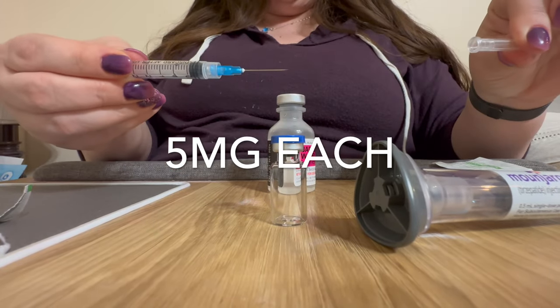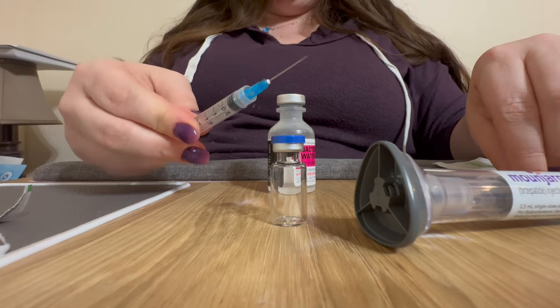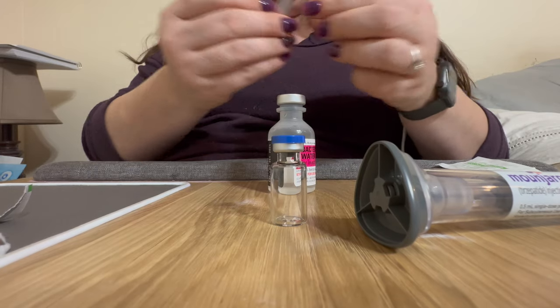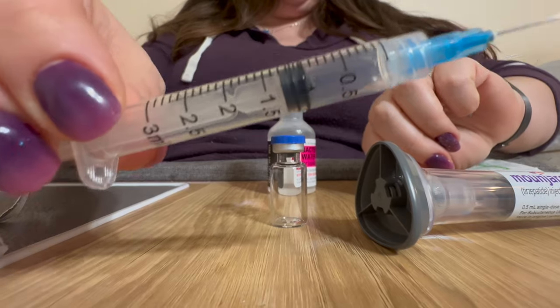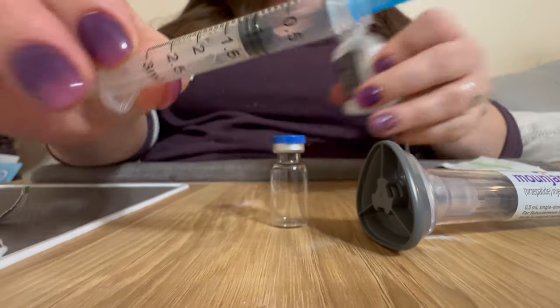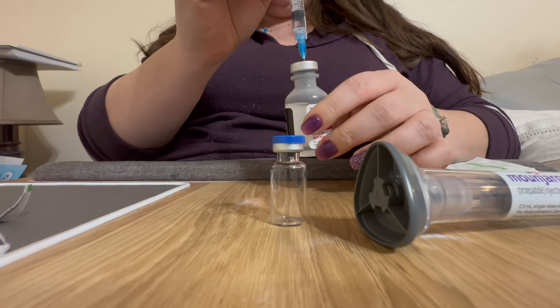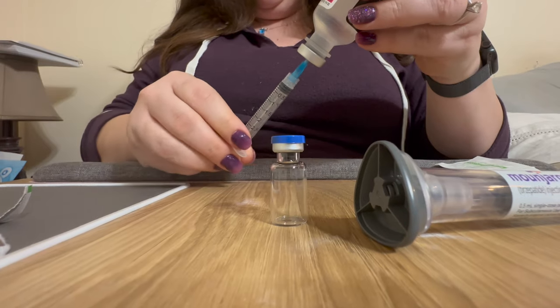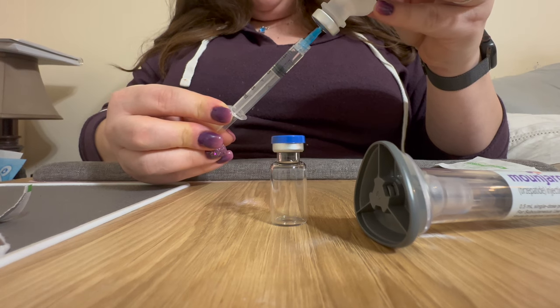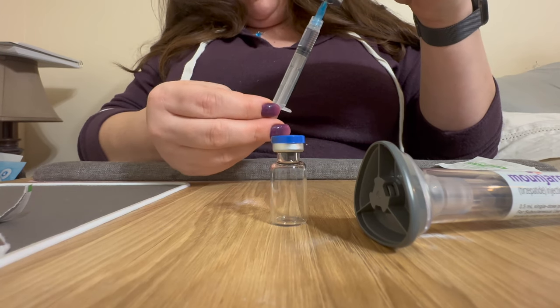Be very careful once that's uncapped — you don't want to accidentally stick yourself. The first thing I do is measure out one milliliter on the syringe. That's just air in there, but it's going to help you get the bacteriostatic water out. Inject the air into the vial before you turn it upside down and draw out one milliliter of bacteriostatic water. Make sure you get the bubbles out so you're measuring accurately.